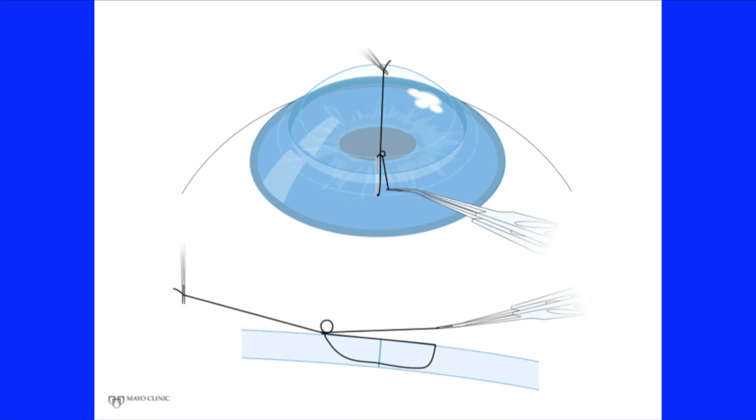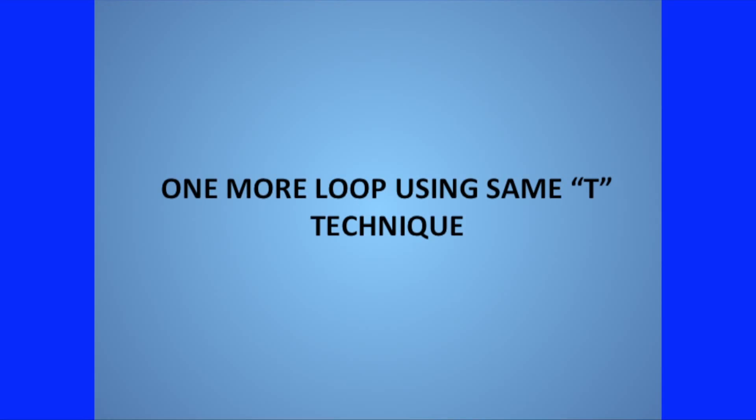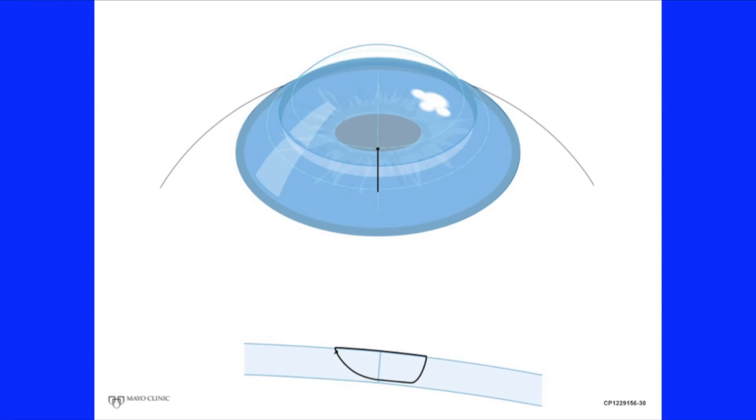Equal tension on both the long and the short suture will make a circle of the loop and will keep it over the first throw of the knot. Pull gently on both ends until the knot is secure. Then make the T again to start the third throw and go through the same steps you used to do the second throw and the knot is complete.